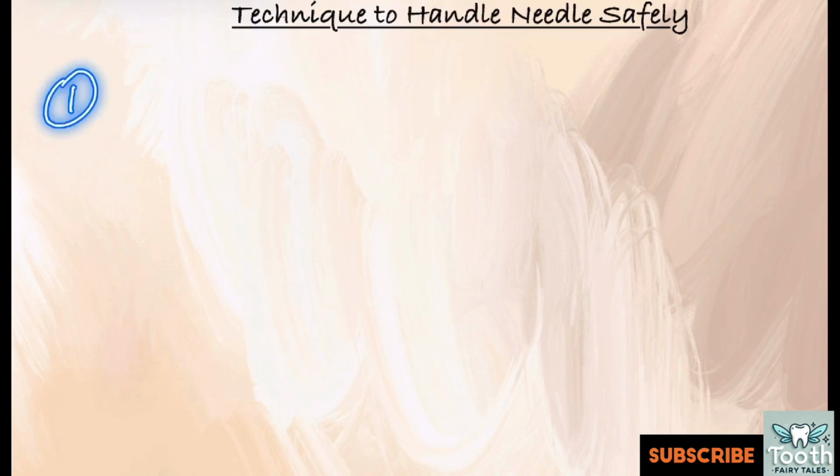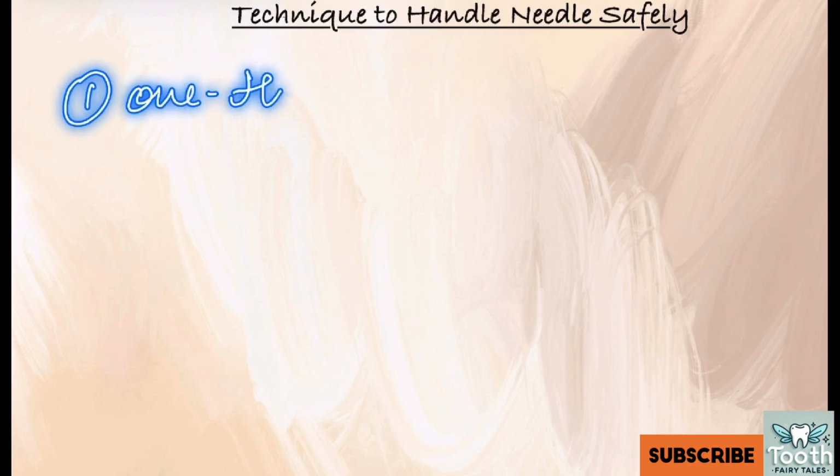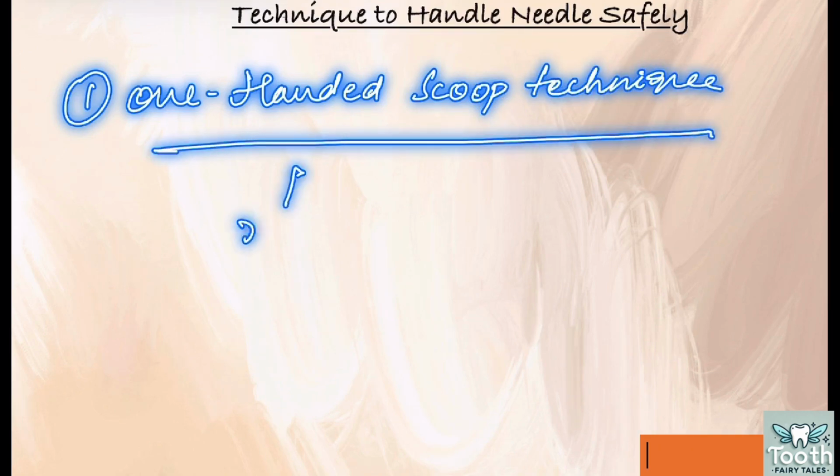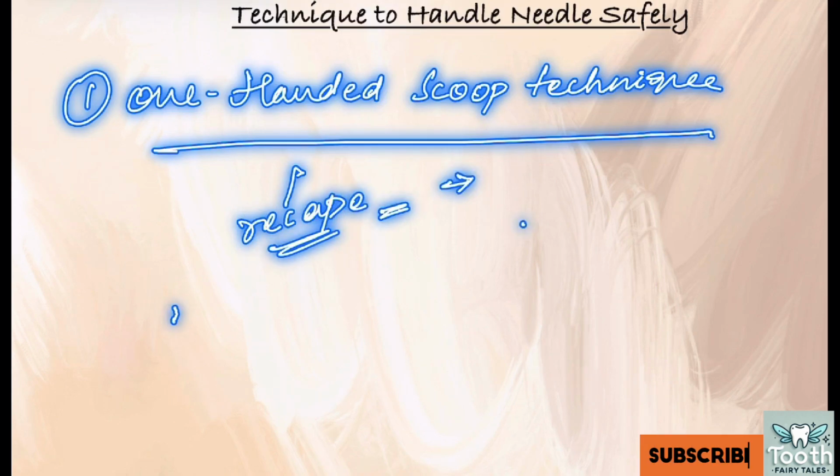First one is the one-handed scoop technique. This is one of the most recommended techniques to recap the needle safely after it is used. The clinician uses the needle to scoop the cap back on with one hand, without touching the cap with the other hand.